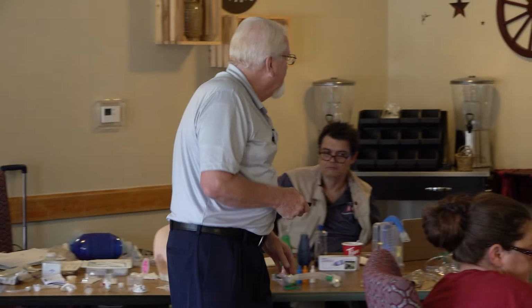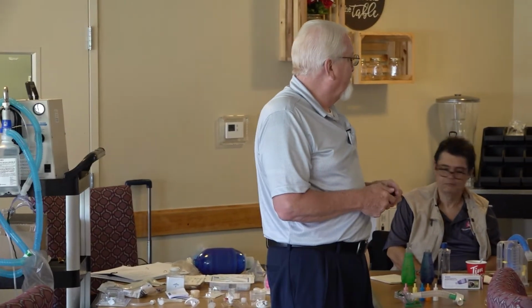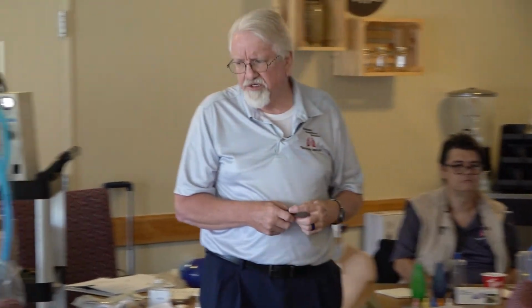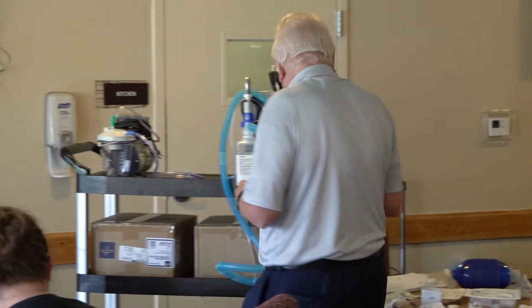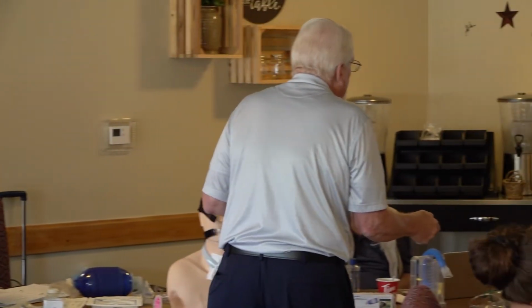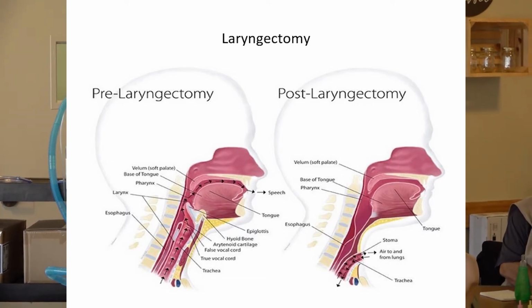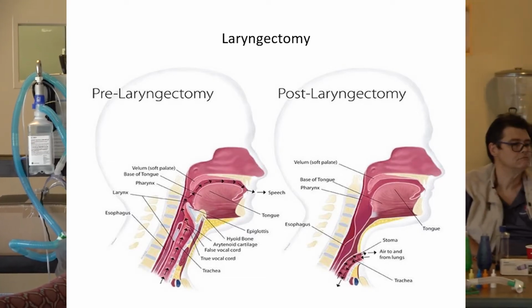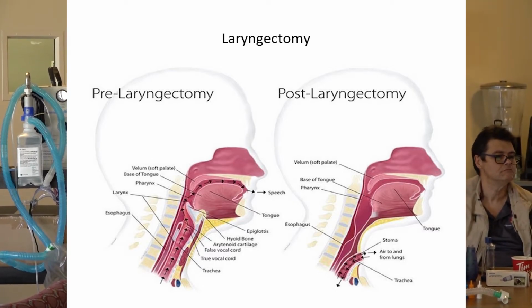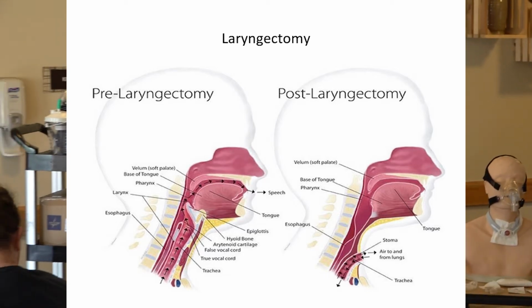So that diagram you have there is the tracheostomy tube on that page in your diagram. I skipped a couple there: tracheostomy versus laryngectomy, and what is a laryngectomy and its purpose. So I've skipped a few, but I'm going to go ahead and explain it.